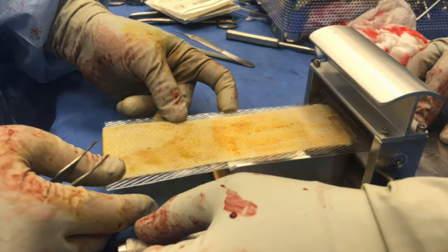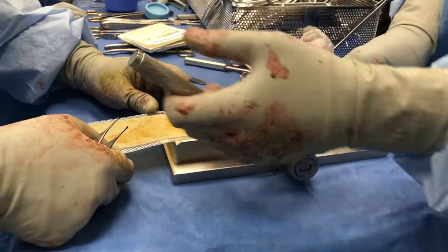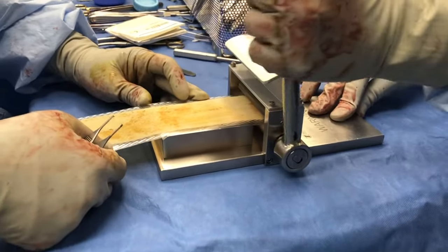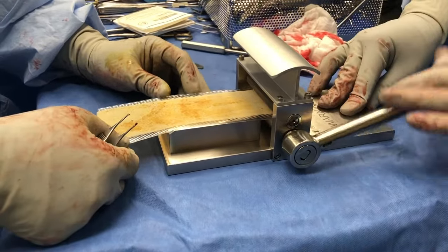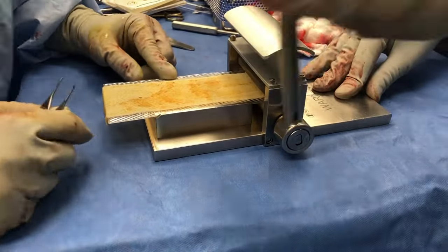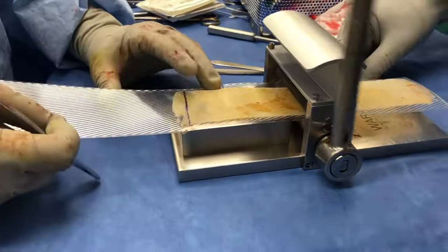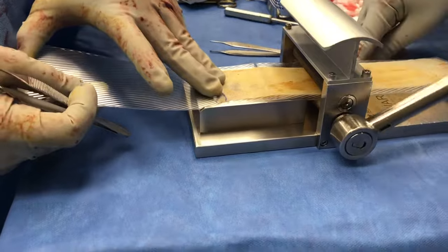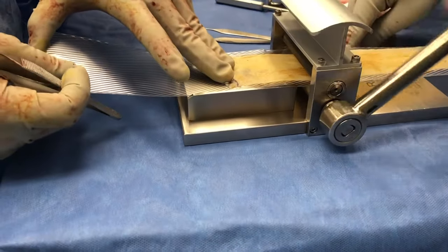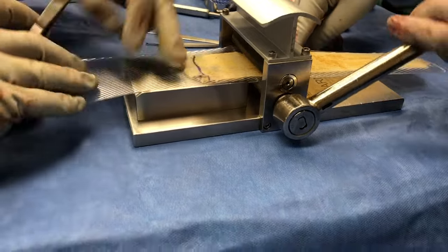The skin graft and tray are loaded into the mesher as shown here. This is a manual unit, and as we pull on the handle this advances the tray into the blades of the mesher. As we get to the end of the tray we notice that there is extra skin graft still hanging off the end. You can use a second tray as a carrier to facilitate safe passage of this through the mesher.